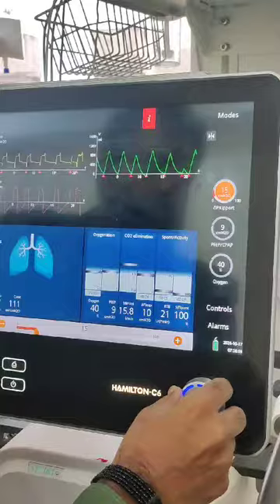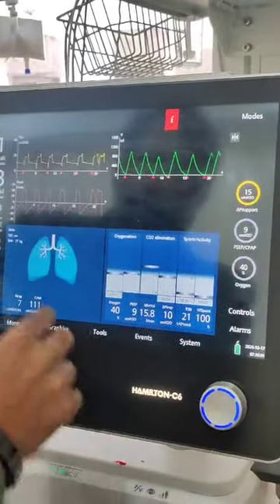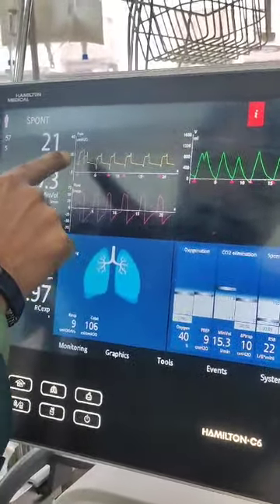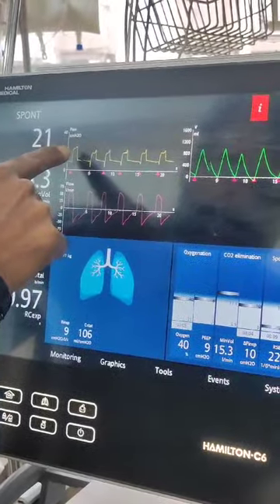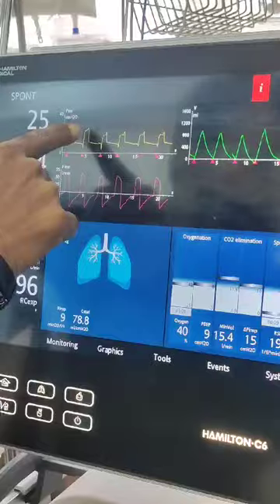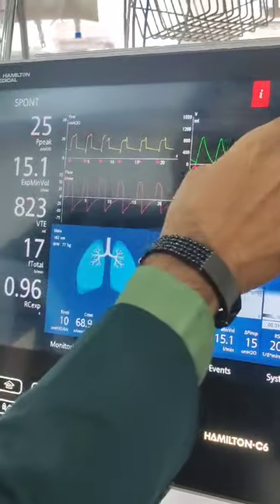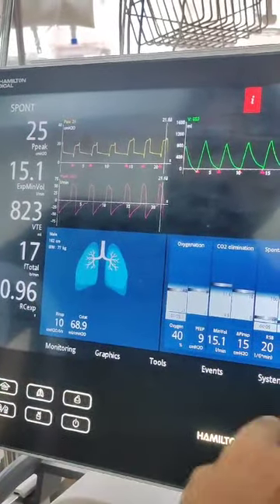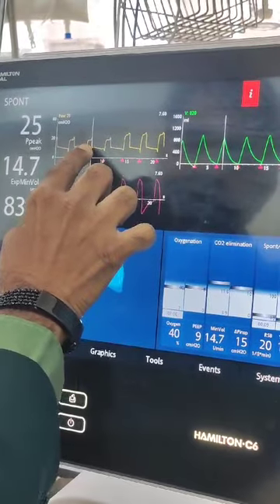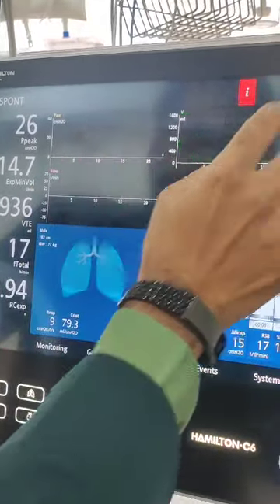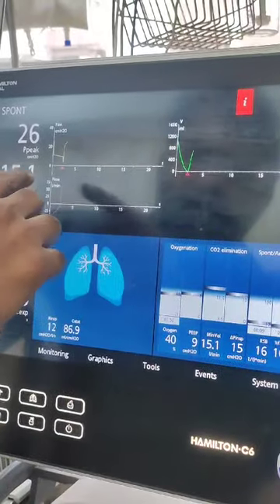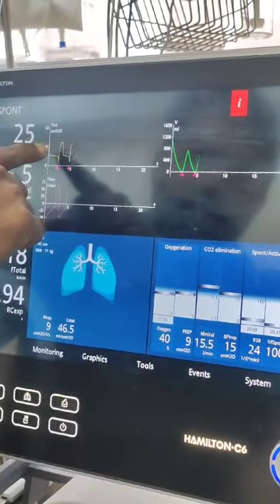I'm going to make it 14, then 15. At 15, let's concentrate on the pressure-time trace. The pressure-time trace seems to slightly reduce the blip now. The blip is still visible but if you compare it to before, it is slightly reduced. Look at the blip here and look at how it has changed — it's a little bit better.